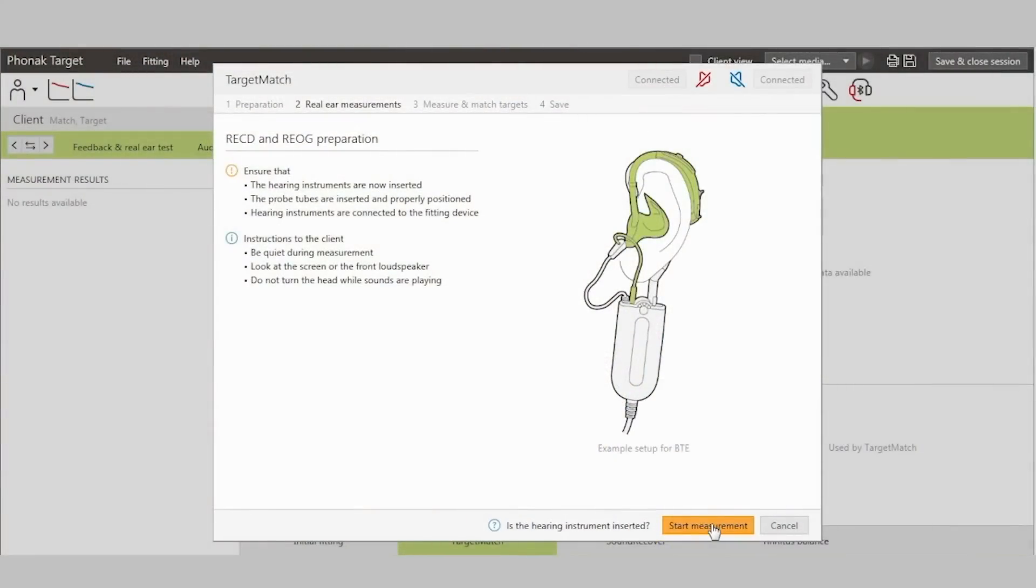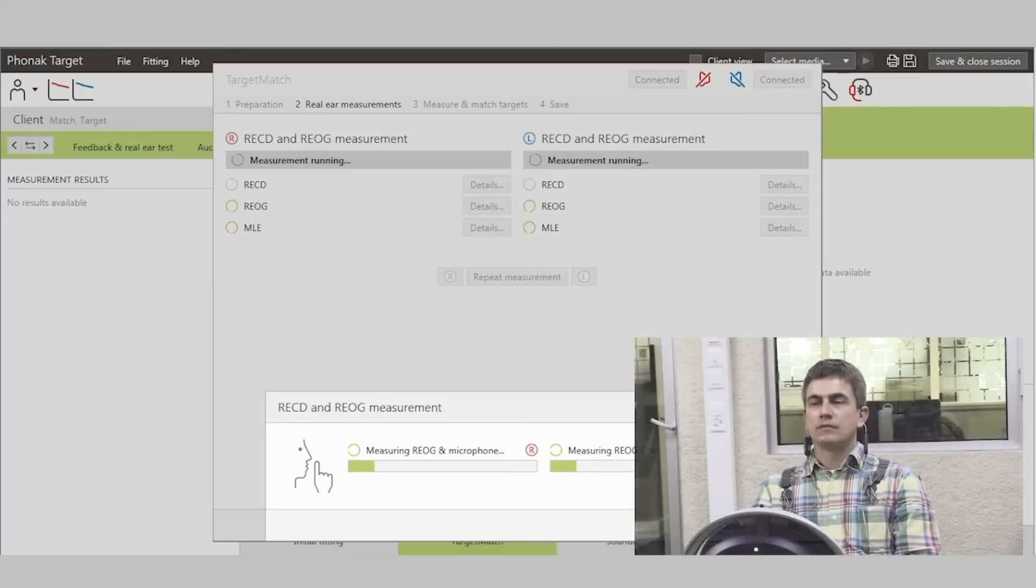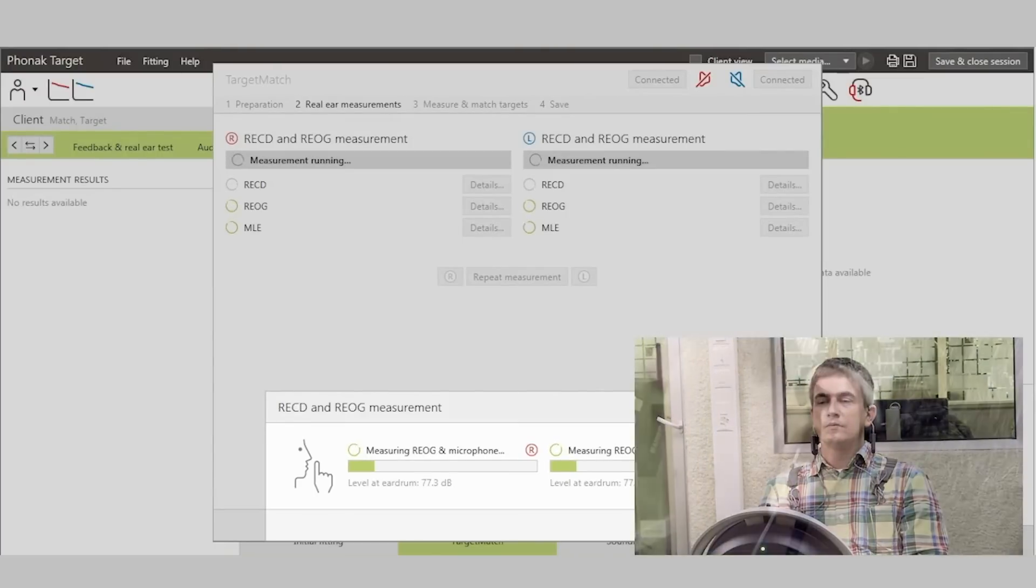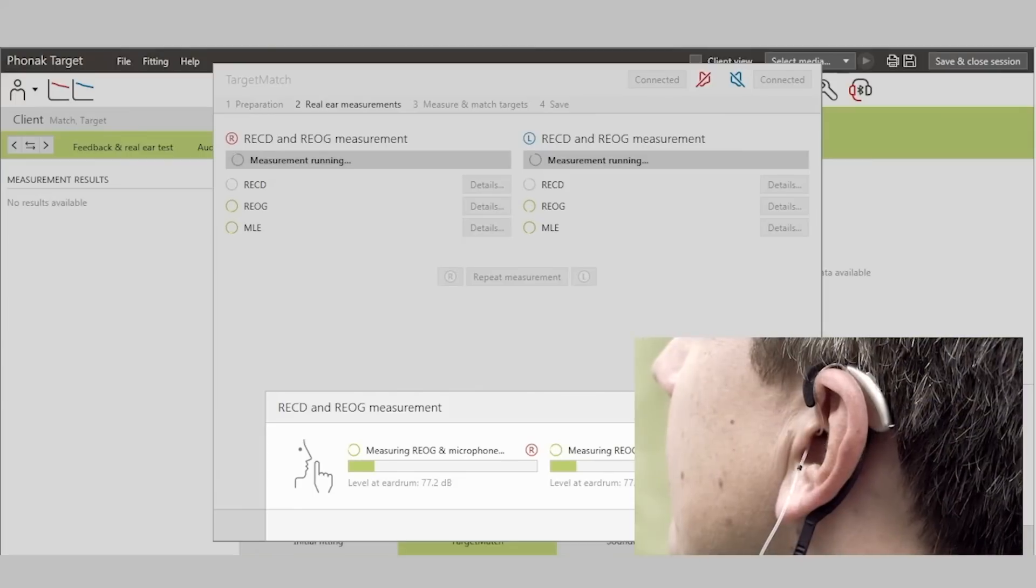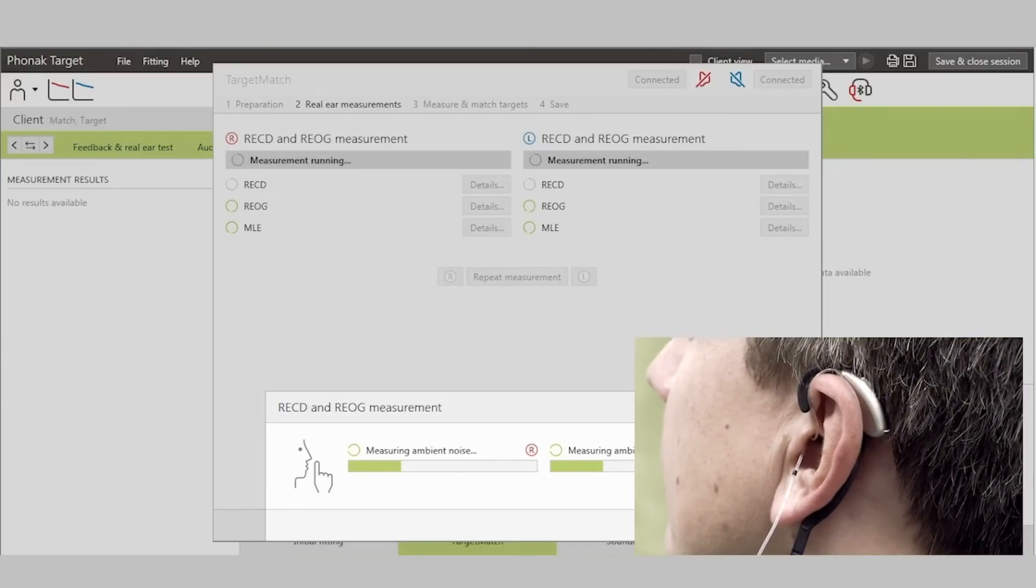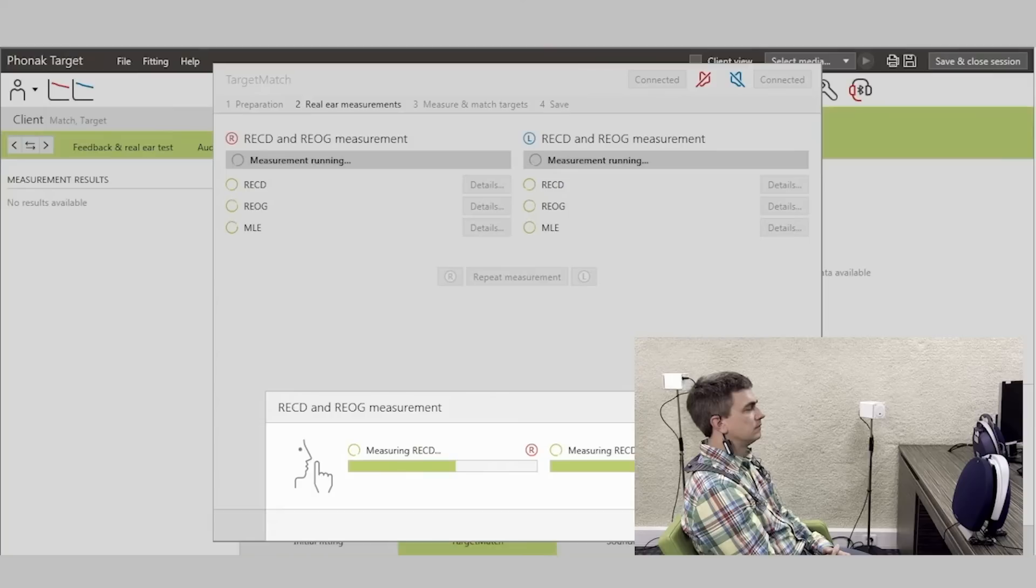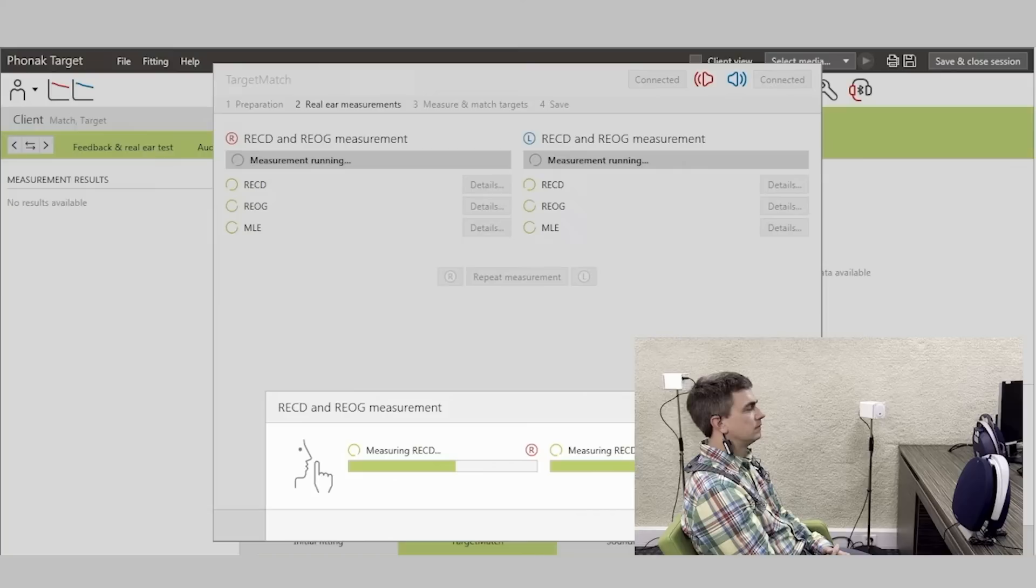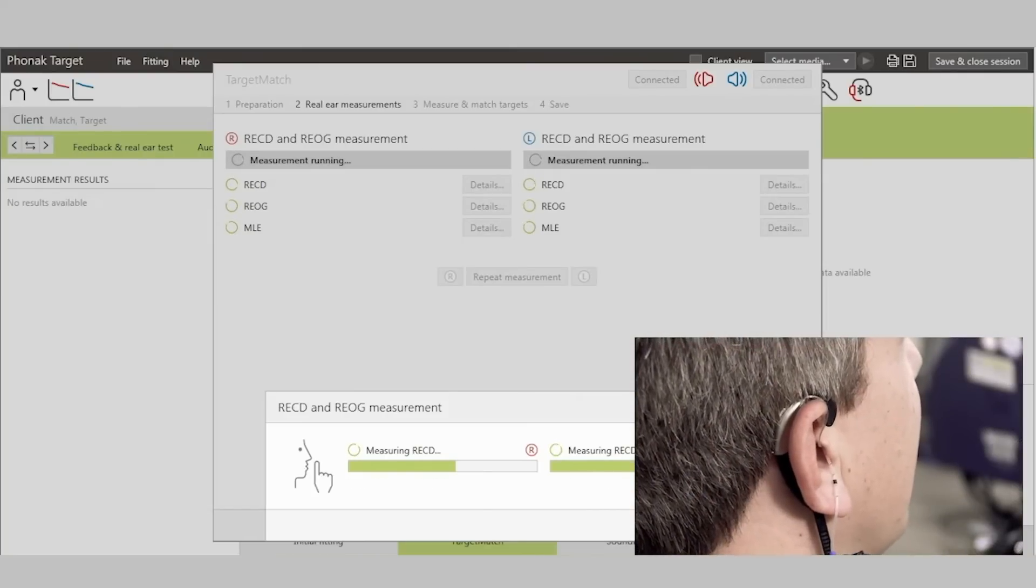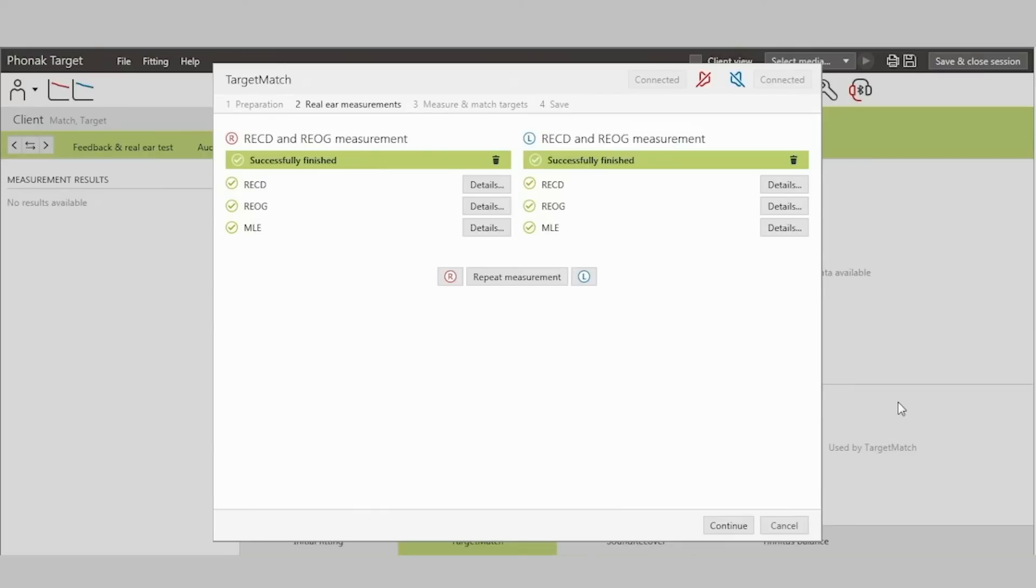The system automatically performs these measurements binaurally without having to touch the client's ear. Press Start measurement to continue. During the RECD measurement, you will not hear any sound. The reason is because the receiver of the hearing aid is being used as the transducer. An overview of these measurements is provided and can be reviewed.